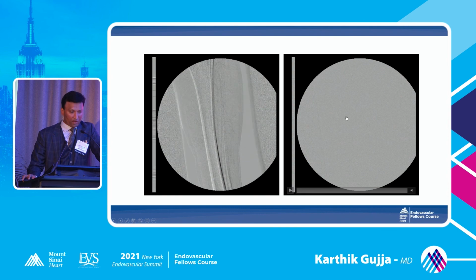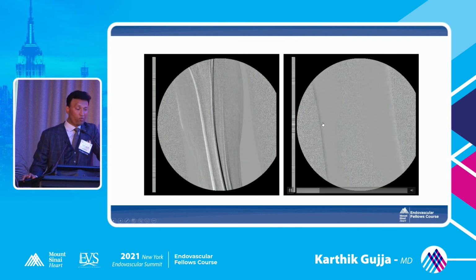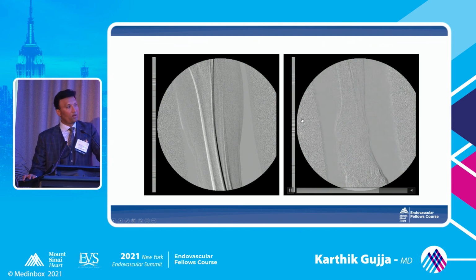Again, we end up with a foot shot. This is very, very important for fellows. You get into a habit of doing it; you have to do it. If you are doing endovascular, then this is a good thing to do. All right. Good. Awesome.